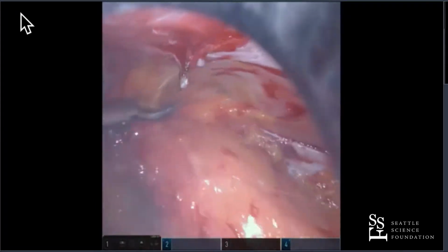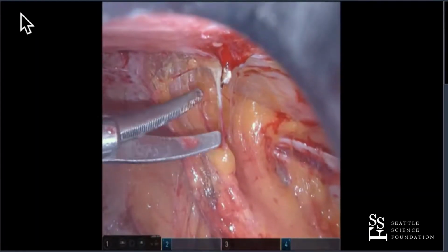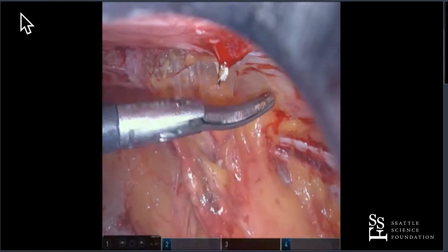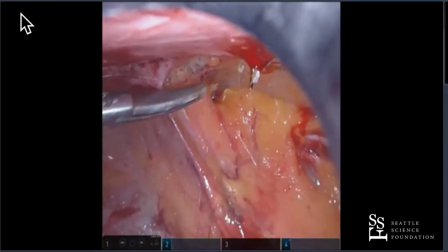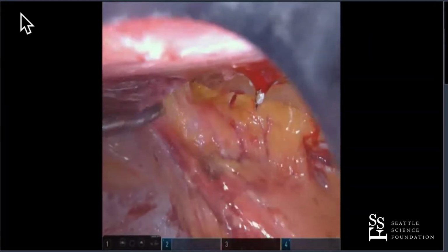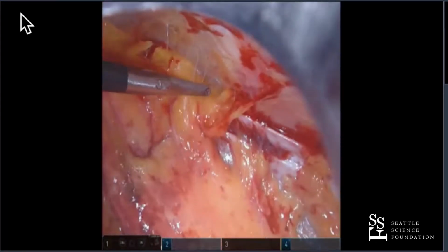All right. I'm doing all this stuff and they're not seeing it, that'd be terrible. Another vessel, go ahead. Taking a little time to take these little perforators is actually nice because it makes your field so much nicer. You can blow through those, but then it's just dripping down on you the whole time. If you take a little extra time, it's probably better for your vision in the long run.